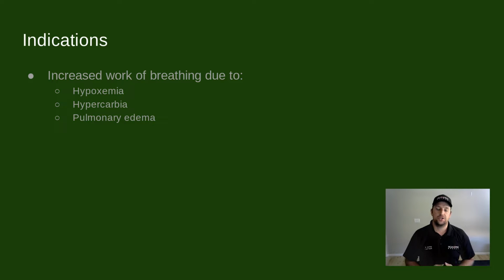For BiPAP indications, we'll talk about it very generalized. I want you to think about using BiPAP in three scenarios: hypoxemia, or low levels of blood oxygen, hypercarbia, high CO2 levels, and pulmonary edema.